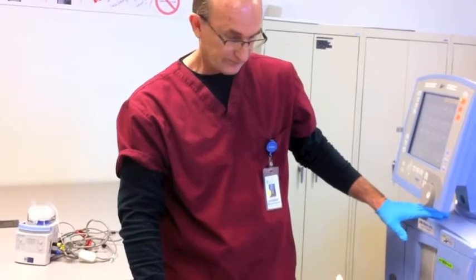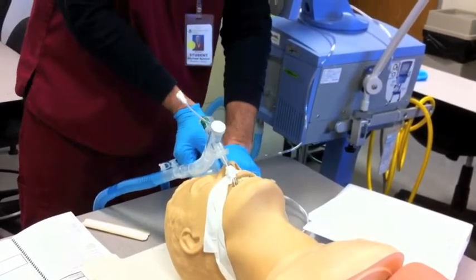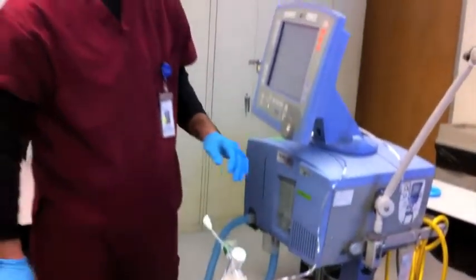Next, he's going to perform any ordered therapy. The patient needs albuterol and Atrovent, so we're going to pour it into the nebulizer. It will run for about 10 minutes.